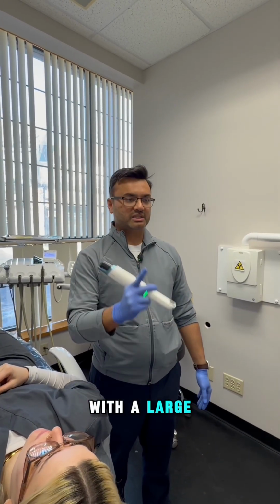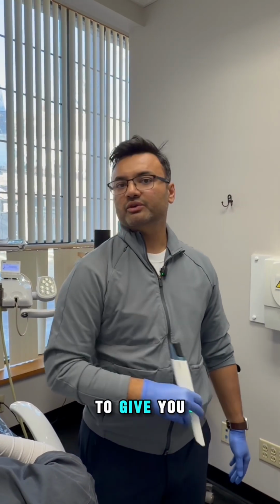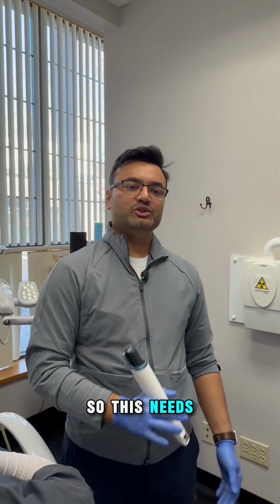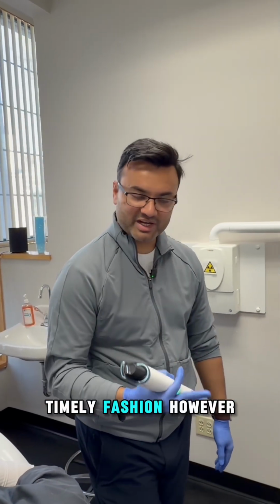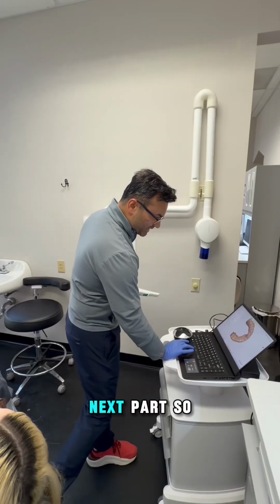You have patients with a large tongue space, you spend 3-4 minutes into scanning, they're going to start to get uncooperative. They're going to start to give you trouble with scanning. So this needs to be done in a very prompt, timely fashion. However, focus on the basics. Can't stress that enough.